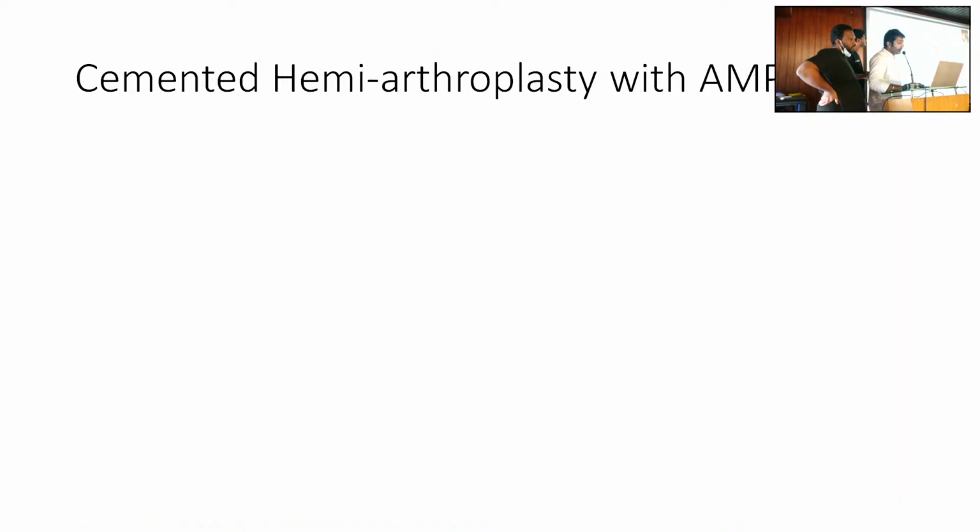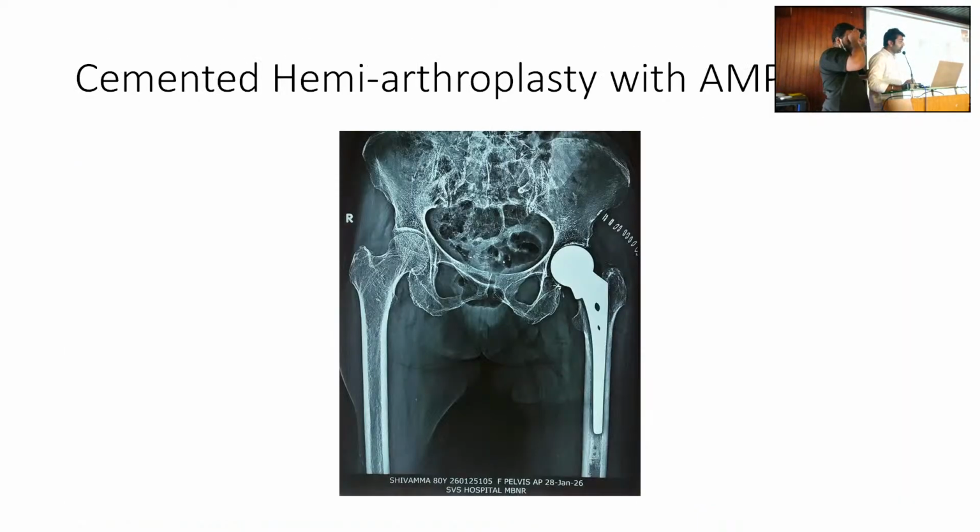Subcapital type, sir. We have done cemented hemiarthroplasty with AMB, sir. Why? Actually, the bipolar prosthesis was from some other company, sir. Did you template before doing surgery? Yes, sir. You don't template also? First we had kept the Austin Moore prosthesis, sir.